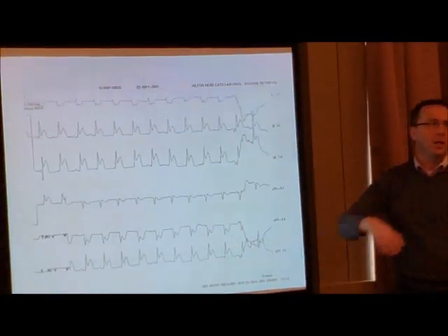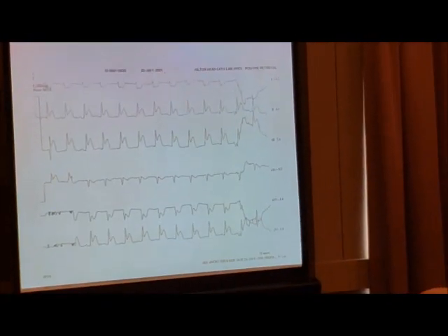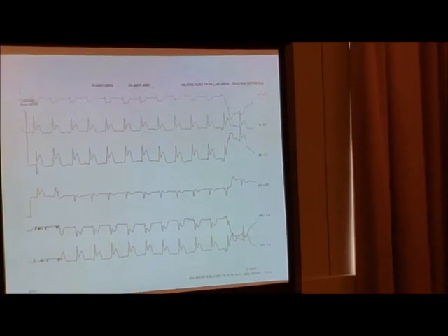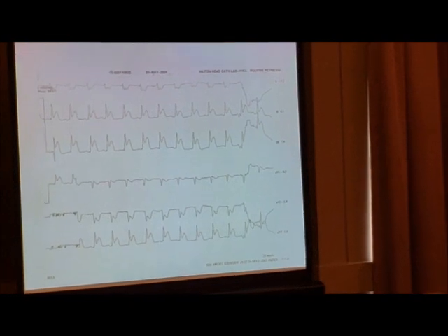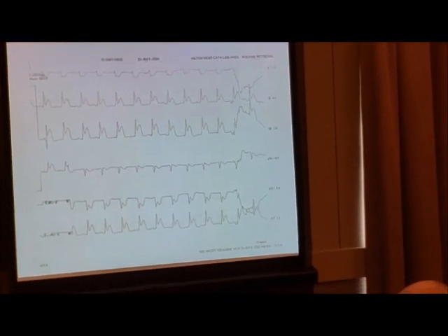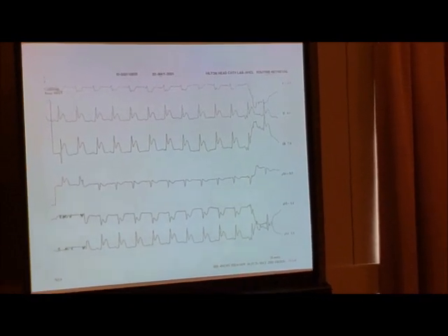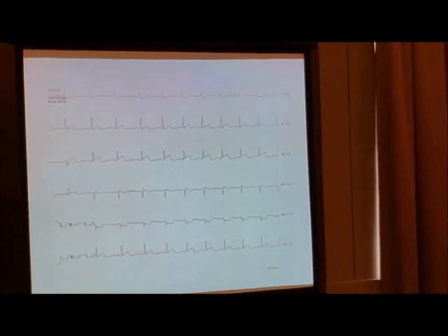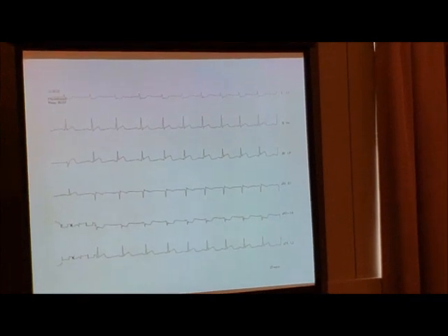The next ECG I'm going to show you is after they crossed this lesion with a wire, and it did turn out to be a proximal RCA occlusion. So this is before, and you'll notice in the next that we have greater than 50% resolution of ST elevation, and boom, that's after they crossed the lesion with the wire and restored blood flow to the patient's myocardium.